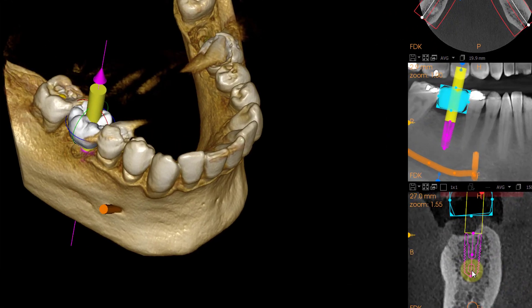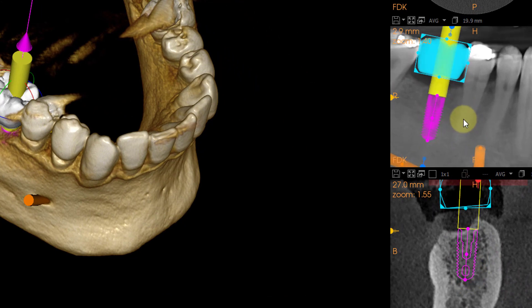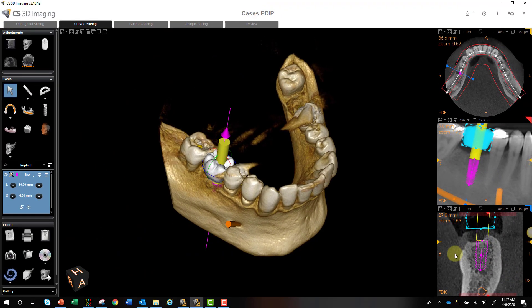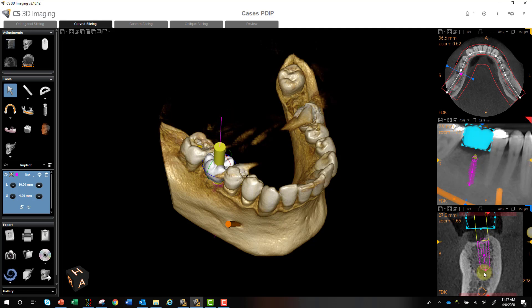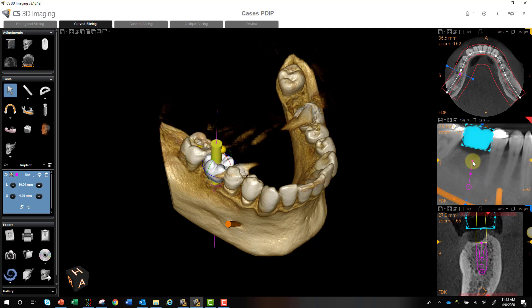There are three nodes in the cross-sectional view and three nodes in the panoramic curve. In the cross-sectional view, grabbing the top node tilts the implant from a buccal-lingual perspective — the apical portion is on a fulcrum. The same applies in reverse: grabbing the apical part puts the coronal aspect on a fulcrum. The middle node provides bodily movement. In the panoramic curve, grabbing the coronal aspect changes the angle from a mesial-distal perspective. As you manipulate the implant, you'll see it change in the 3D rendering on the fly.